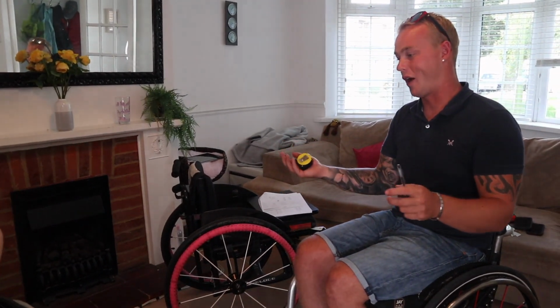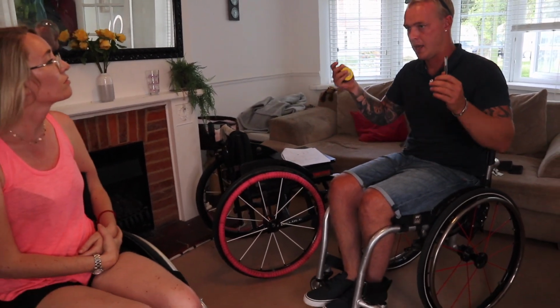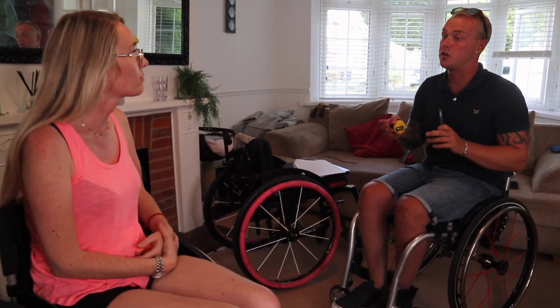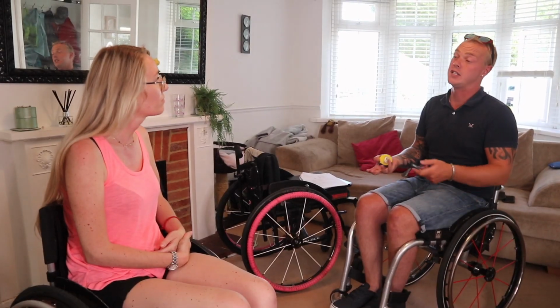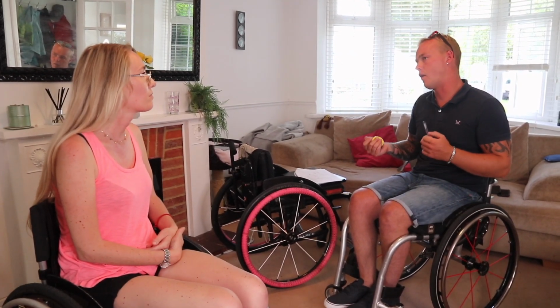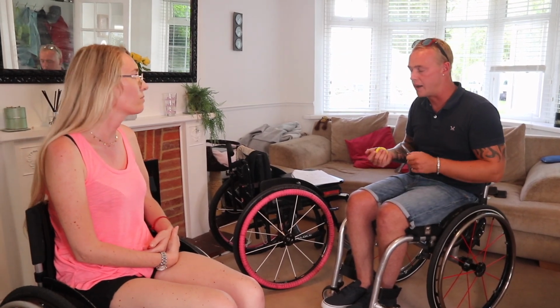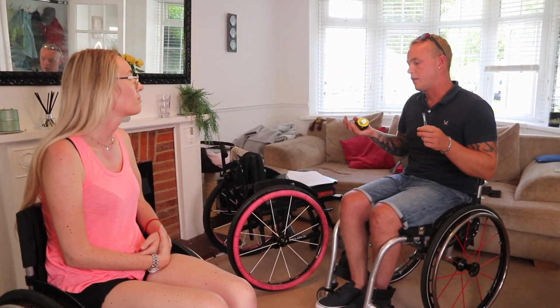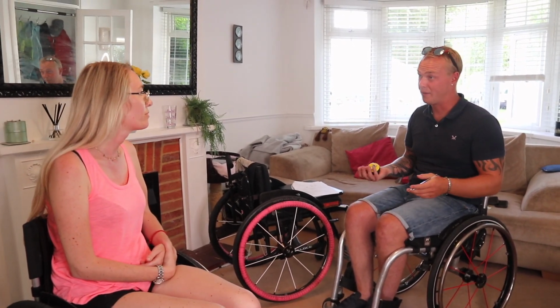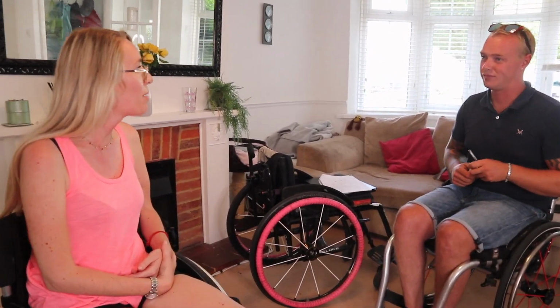Obviously, if you're having a Mustang, back to when we were talking about adjustable chairs, if it's someone newly injured, you'd always allow a little bit more room, because you don't know your growing room, you could potentially gain a little bit of weight. So that's always something you've got to factor in, more so for newly injured people than for those 10, 15 years down the line. Because the whole point of a lightweight wheelchair is to have it nice and snug. But for yourself, you've been in the chair for a long time, are you happy with your width? I am happy with my width.